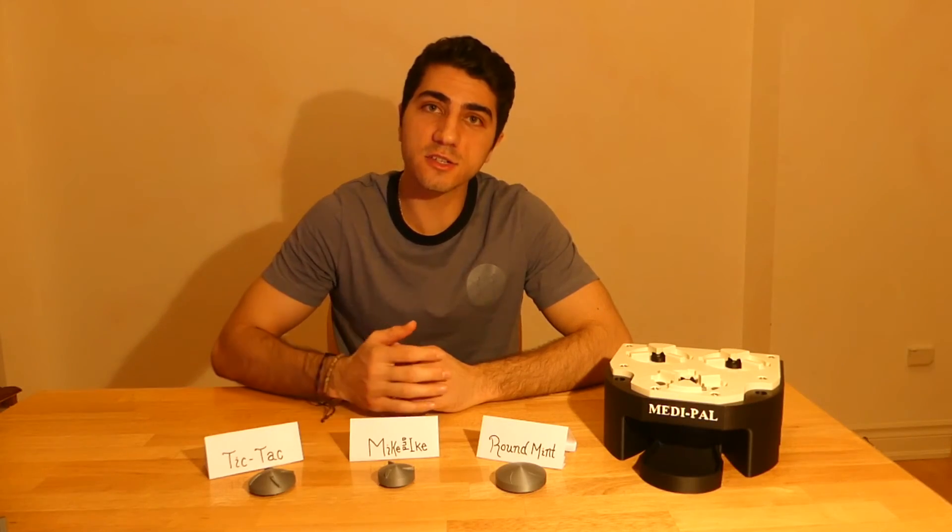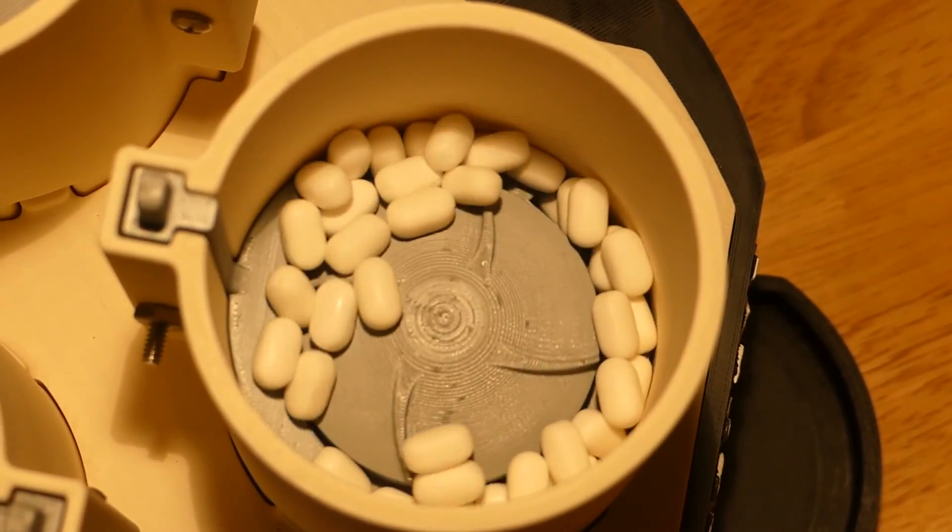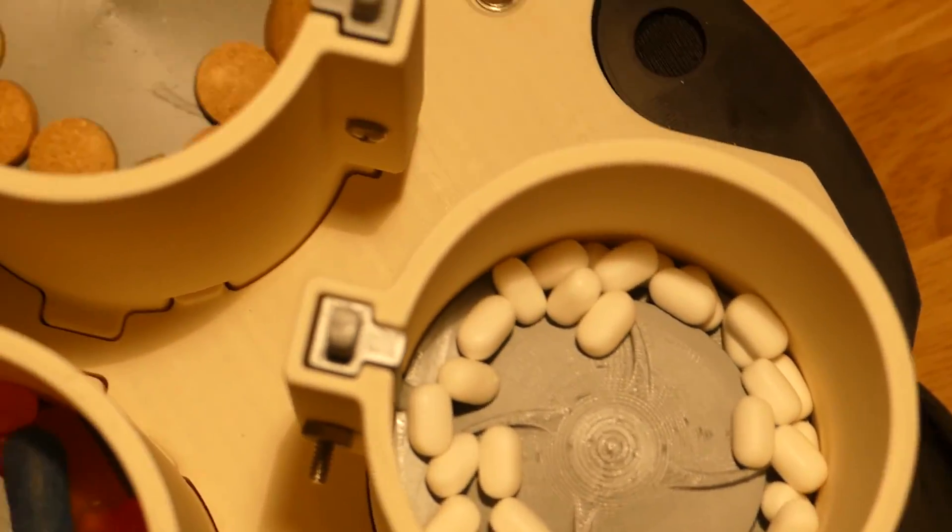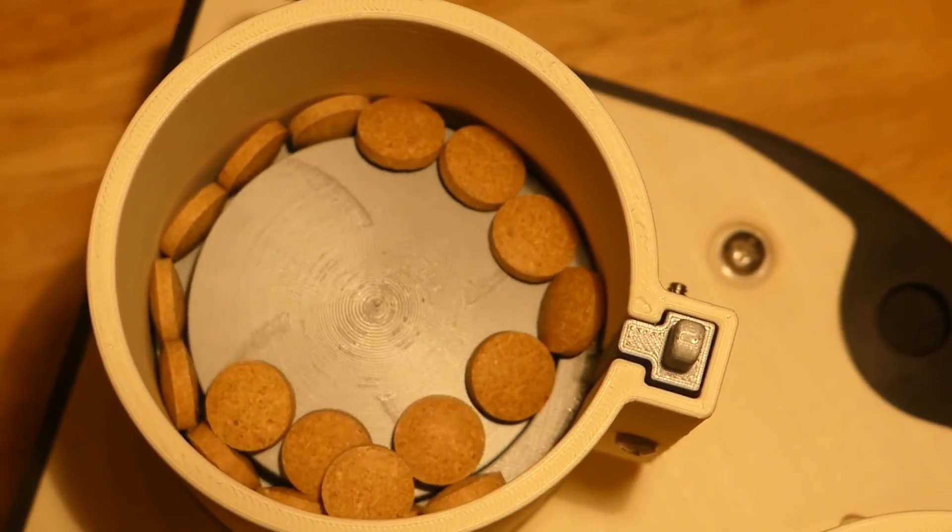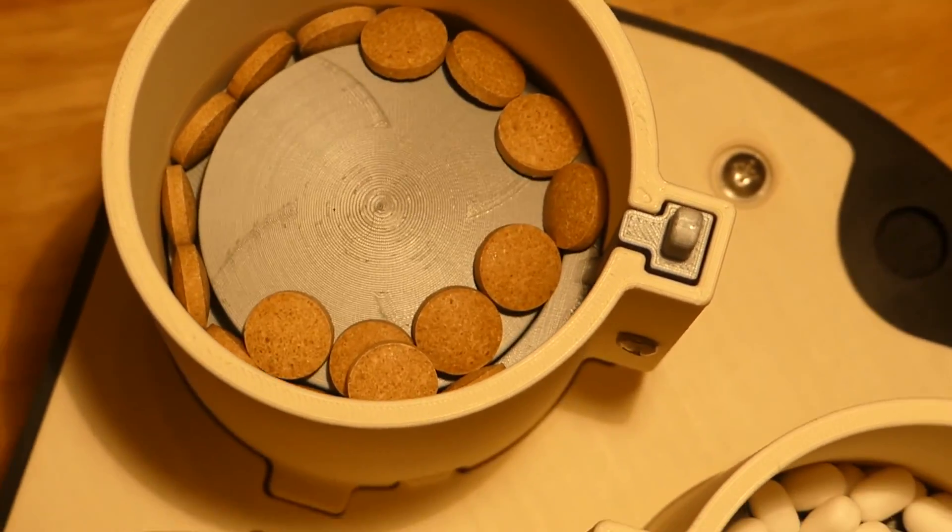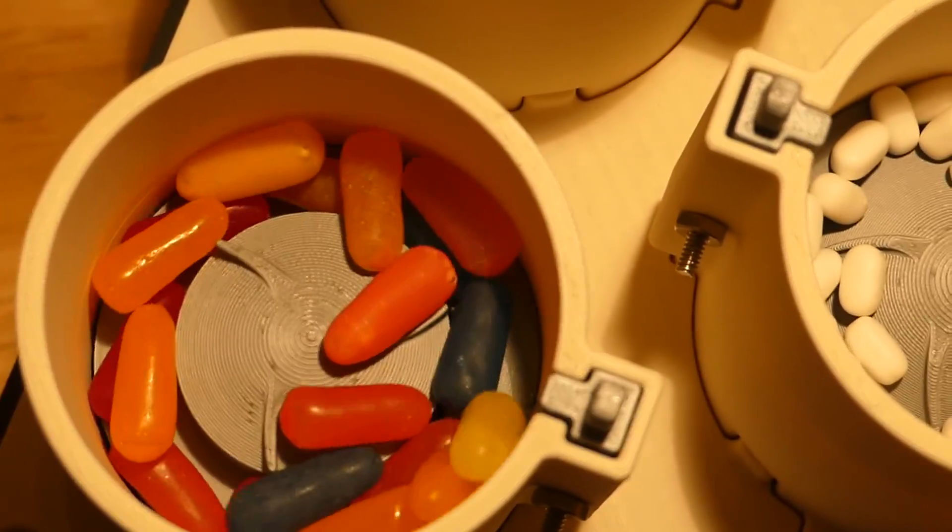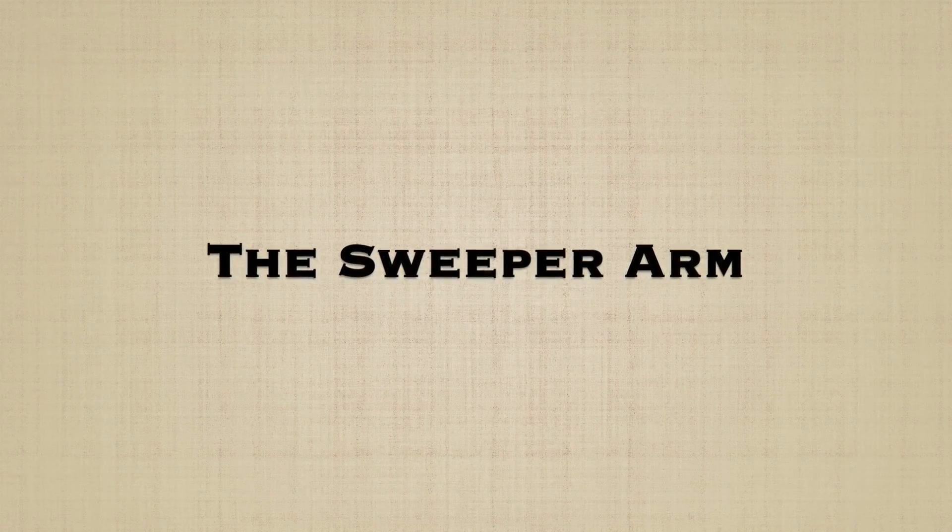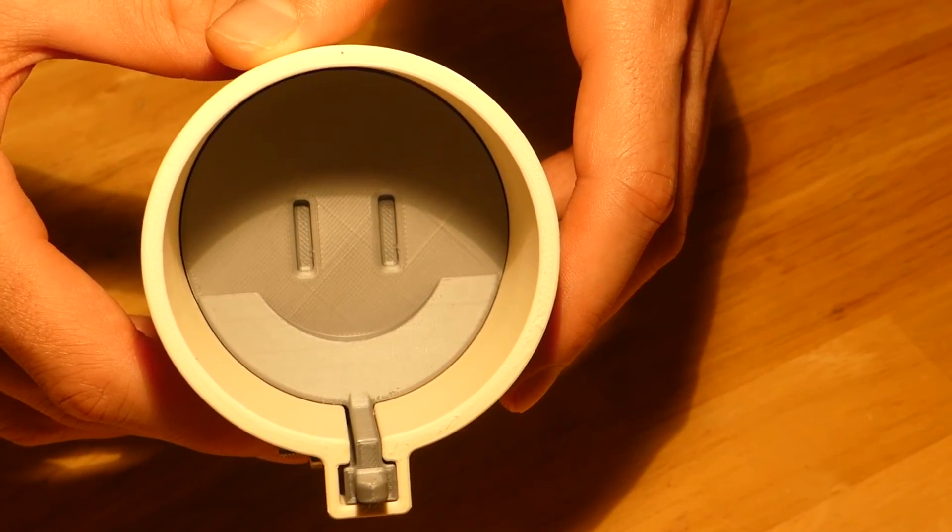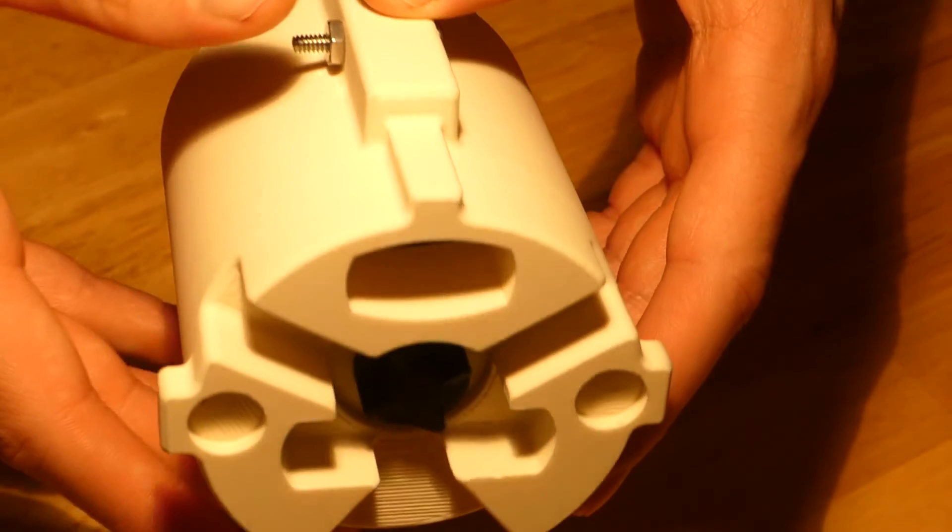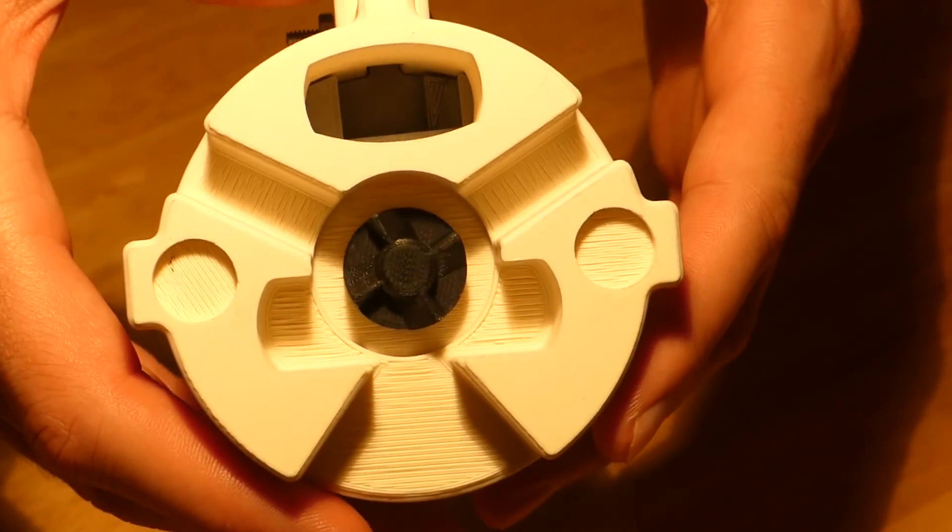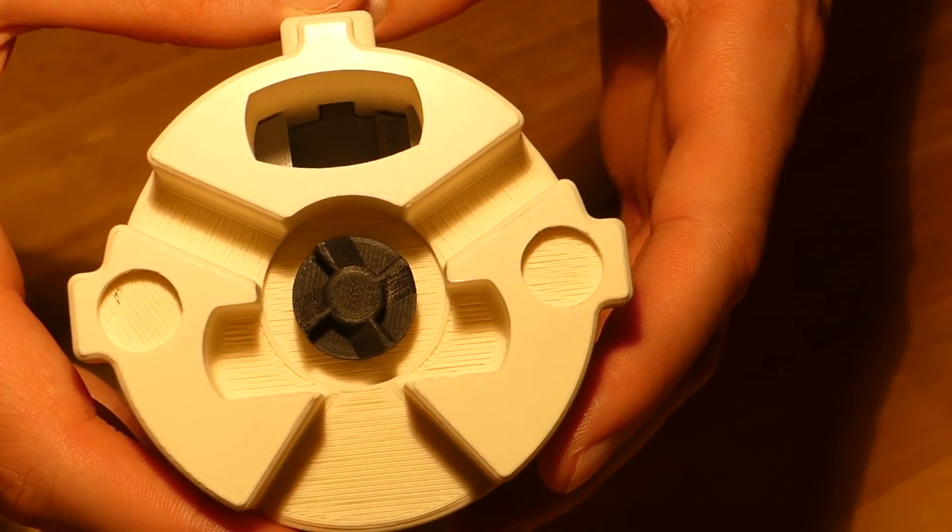The agitator piece ensures there is movement of the pills in the cylinder and prevents bunching of pills that may prevent a pill from falling into the slot in the rotating disc. The sweeper arm rests above the hole in the bottom of the cylinder and ensures that only one pill is dispensed when the slot in the rotating disc lines up with the hole in the cylinder.